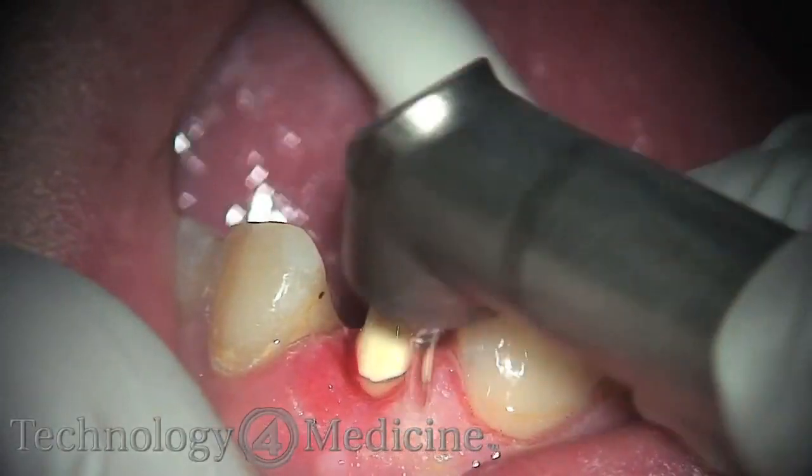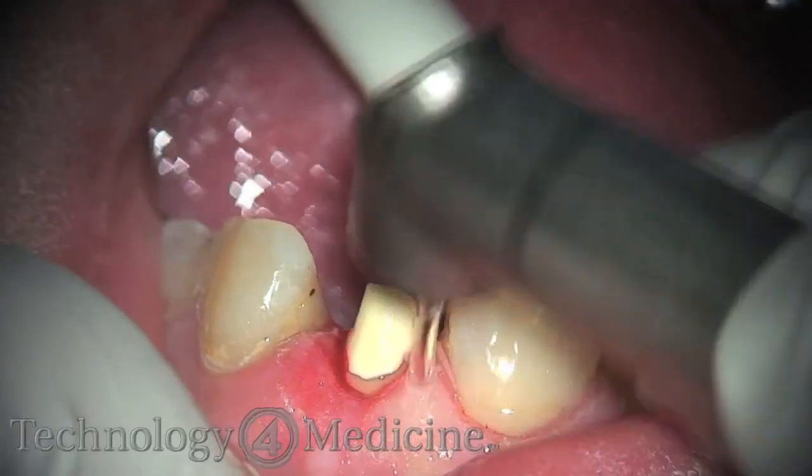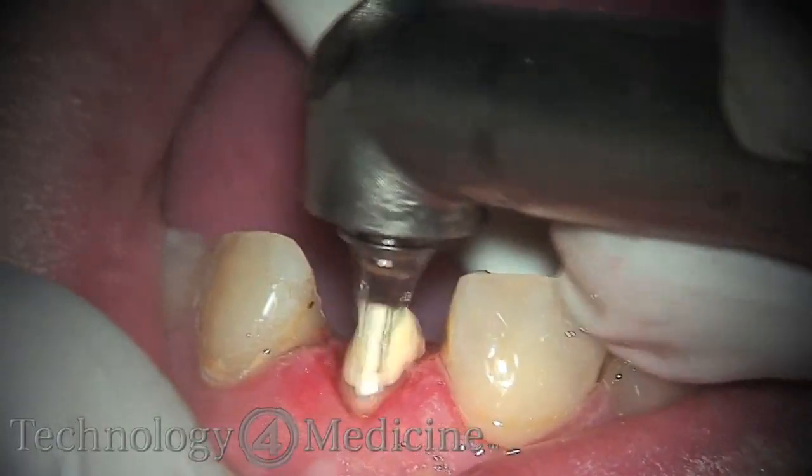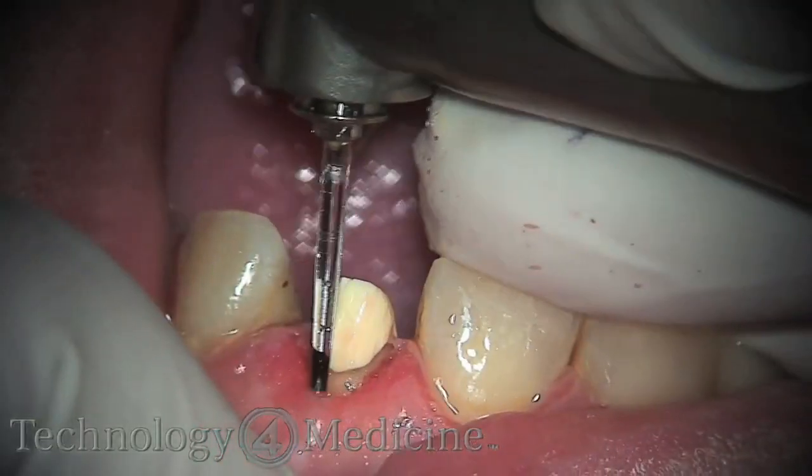With these principles in mind, the laser is incredible for contouring tissues — as you can see what I'm doing here in the videos today.